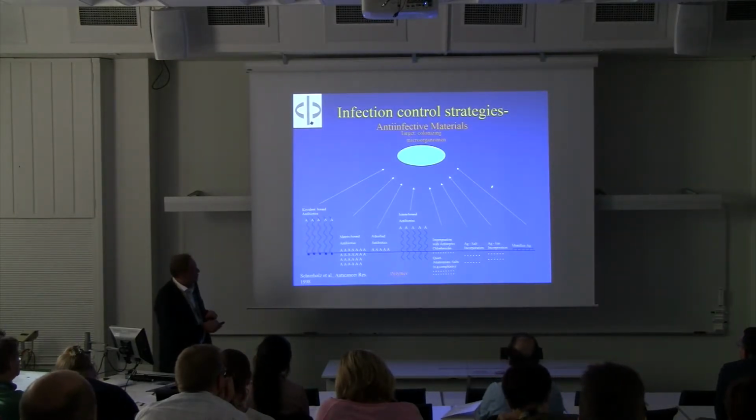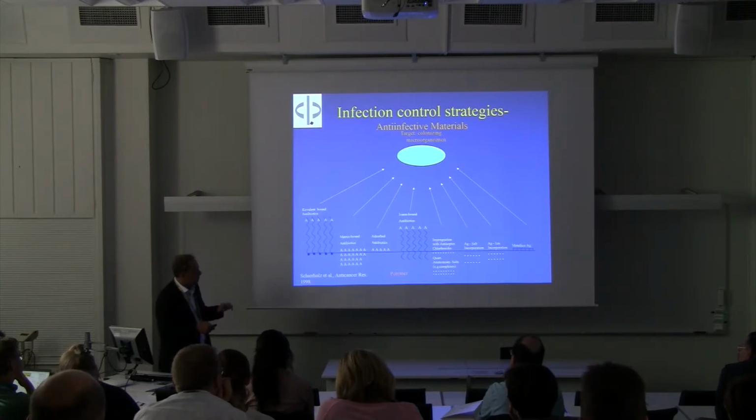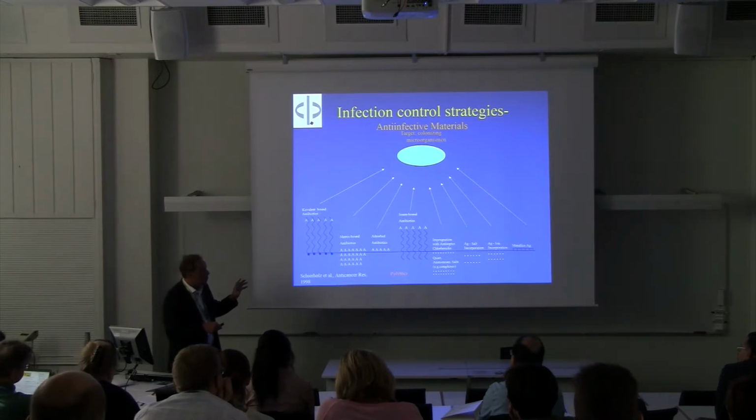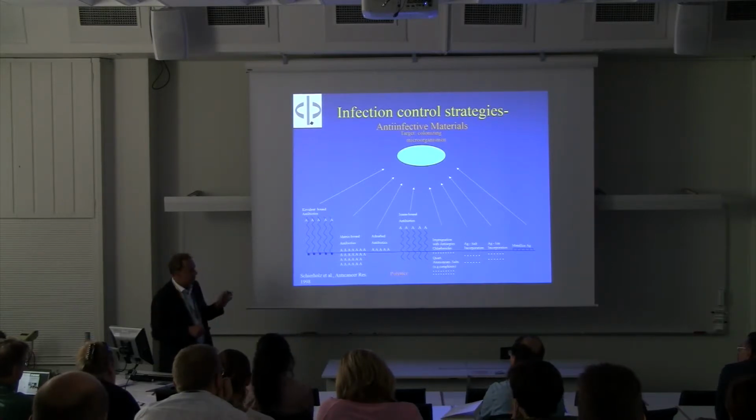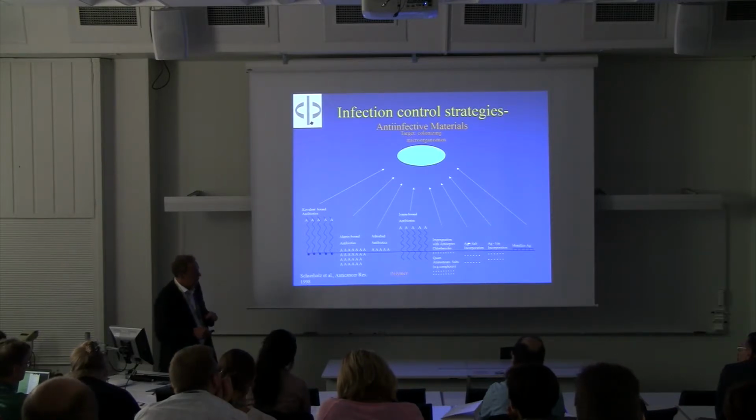So, this is a picture of the attempts for silver, antiseptics as well as antibiotics. We have the so-called matrix-bound antibiotics. Antibiotics are embedded in the depth of any material. Examples are the rifampin miconazole catheters. We have the adsorption of antibiotics. These products have been launched into the market 20 years ago, but removed. We have ion-bound antibiotics. These are the rifampin minocycline catheters, and we have the impregnation with chlorhexidine. These are the chlorhexidine catheters by the company Arrow, and we have some attempts to put silver on the surface or into the material of catheters.